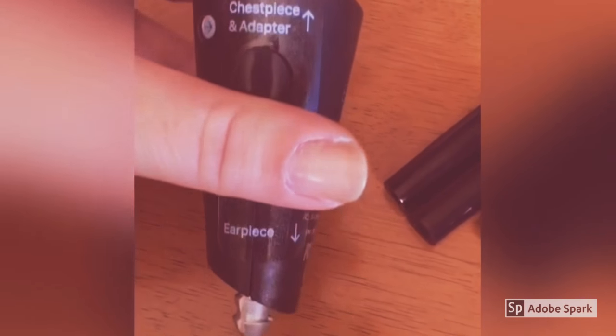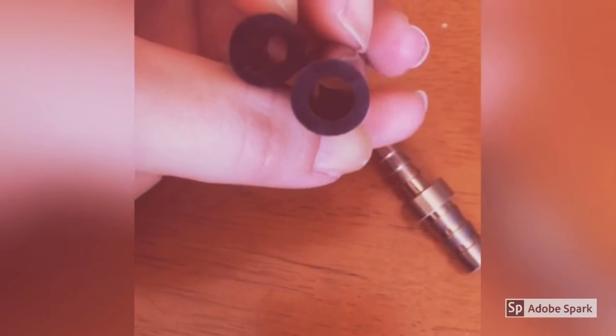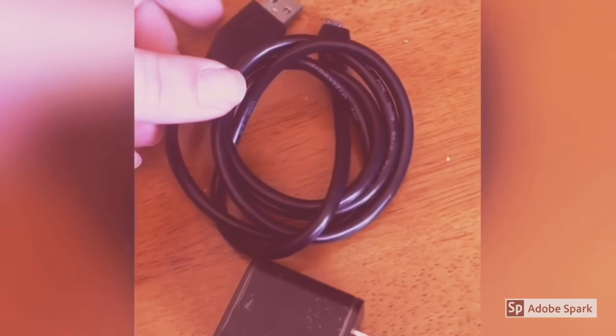We've got the main piece here — the amplifier — which seems pretty sturdy. We've got a couple of little extra pieces to attach it to the stethoscope depending on the size. And then I think this might be an extra piece because I don't think I need this. And then of course you've got your brick and your power cord, which seems fairly long.